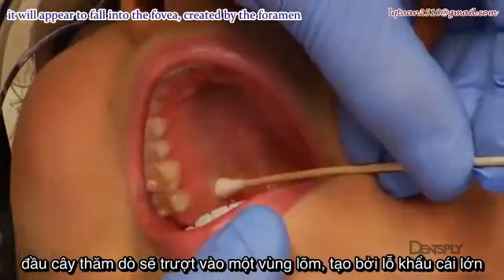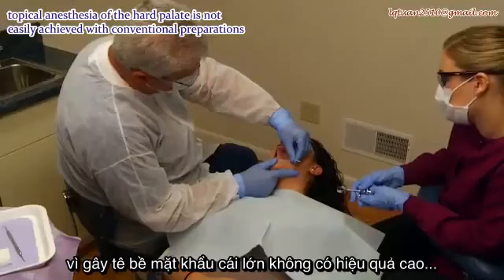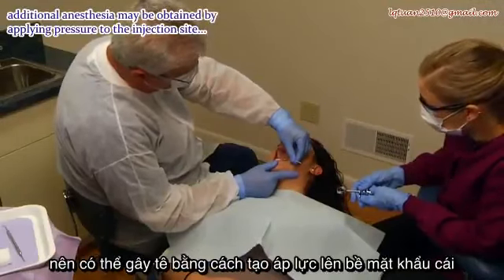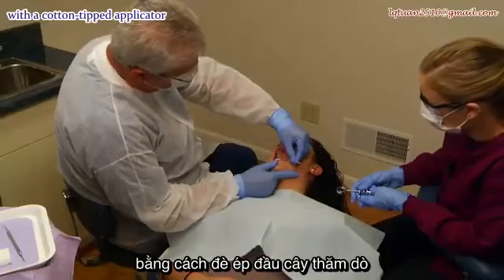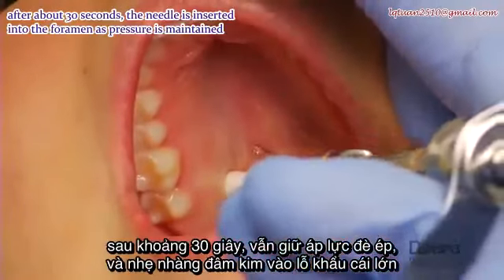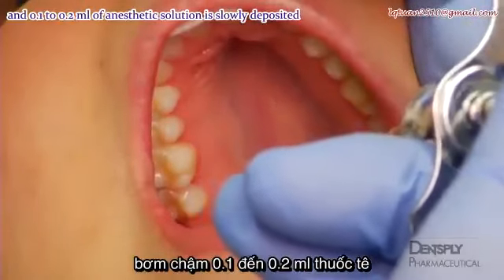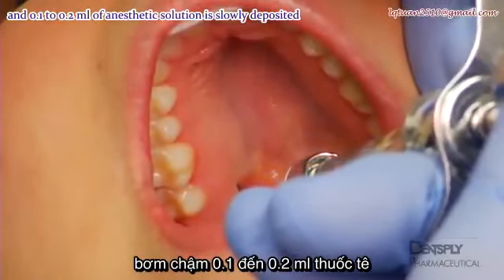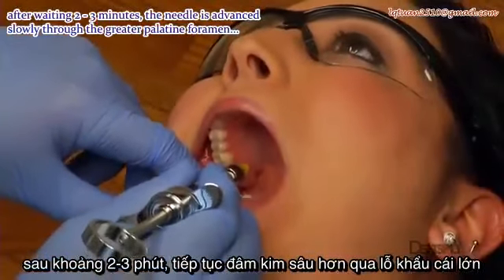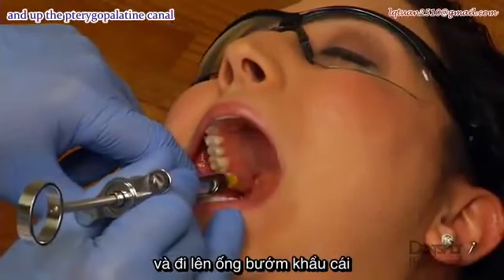Topical anesthesia of the hard palate is not easily achieved with conventional preparations. Additional anesthesia may be obtained by applying pressure to the injection site with a cotton-tipped applicator. After about 20 seconds, the needle is inserted into the foramen as pressure is maintained and 0.1 to 0.2 milliliters of anesthetic solution is slowly deposited. After waiting 2 or 3 minutes, the needle is advanced slowly through the greater palatine foramen and up the pterygopalatine canal.